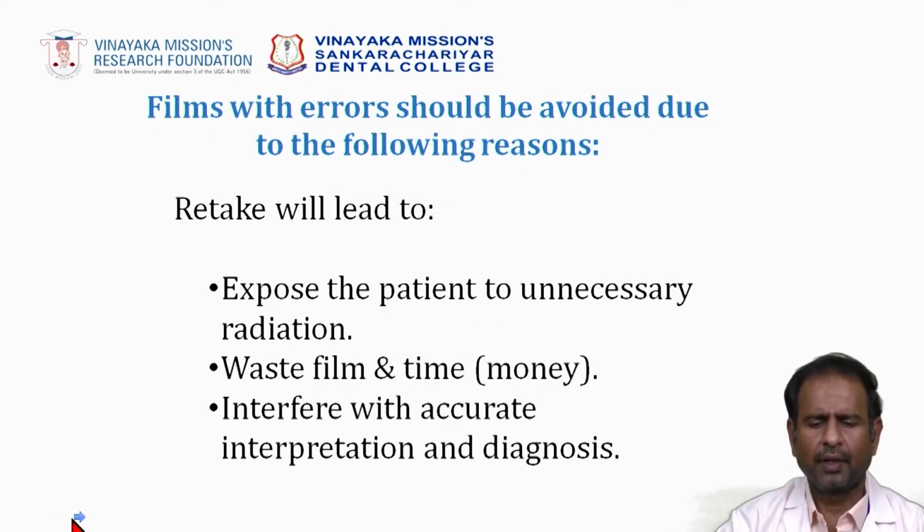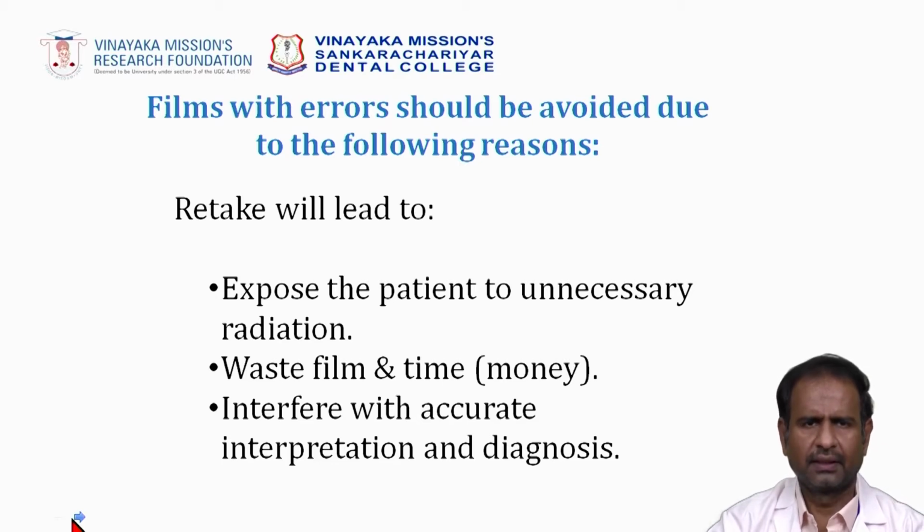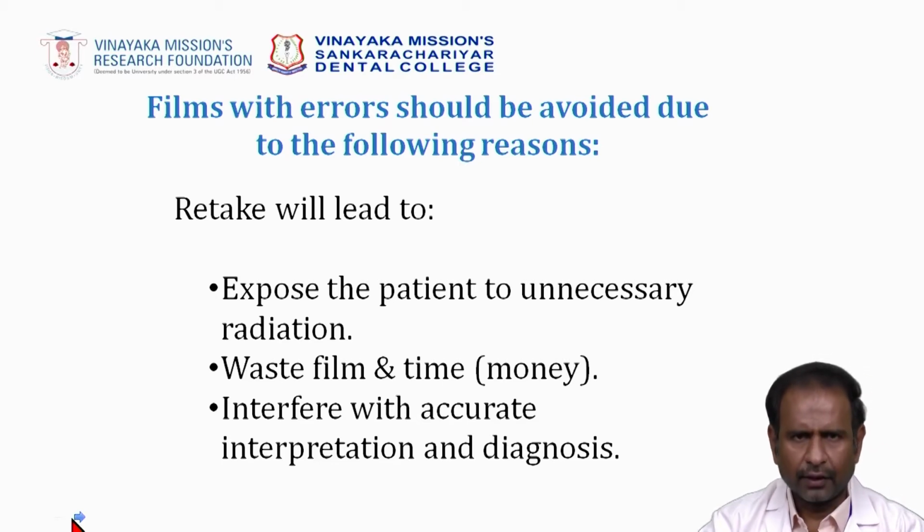Today my topic is radiographic errors and artifacts. Films with errors should be avoided for the following reasons. They expose the patient to unnecessary radiation, waste film and time, and interfere with accurate interpretation and diagnosis. This is the reason we need to take errorless radiographs.